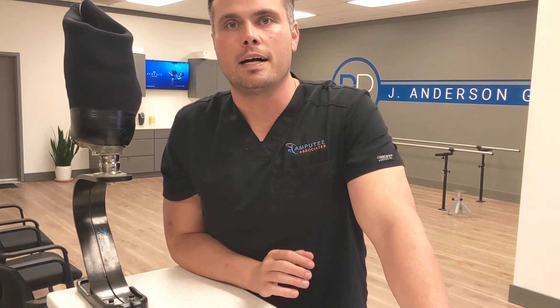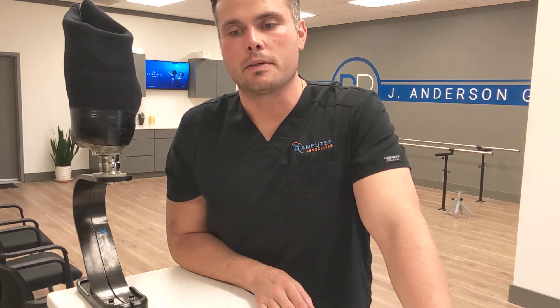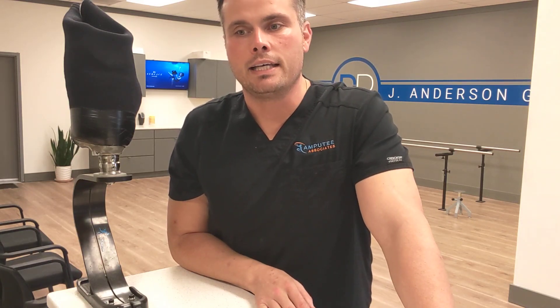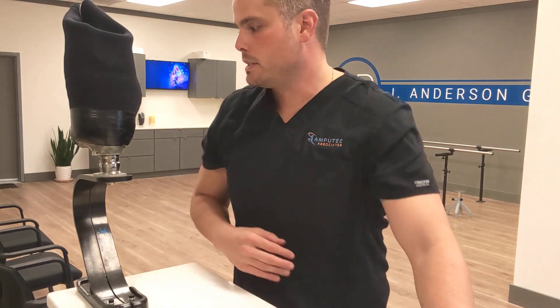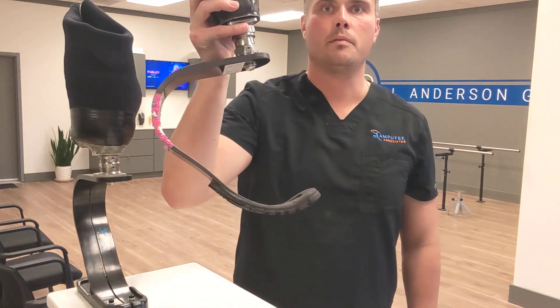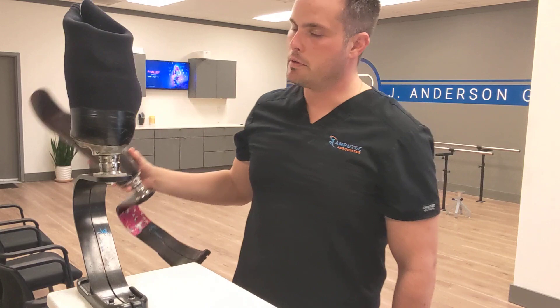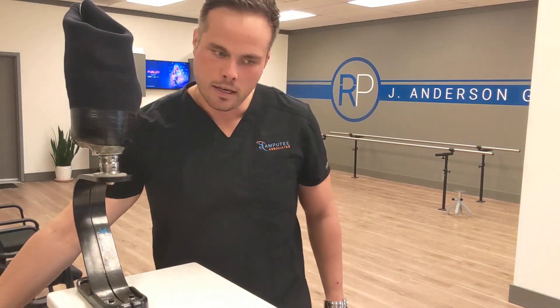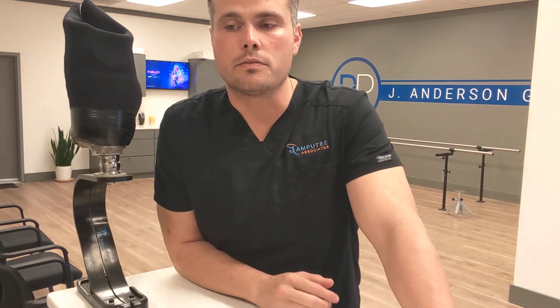Hi everyone, this is Zach. I wanted to go over this modification to our running prosthesis that we did for a patient. He came to us with an existing running foot, which is basically a carbon fiber spring with no heel, basically running on the toe, and he did remarkably well with that — only when he was running on pavement, concrete, or flat surfaces.